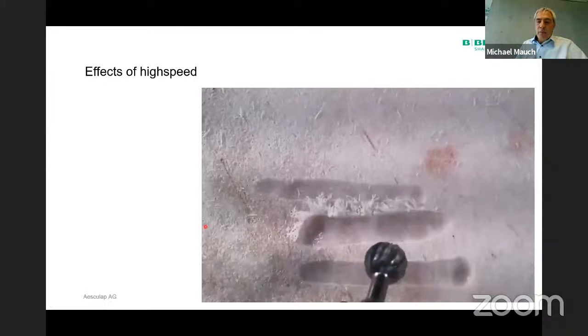But how much chattering and jumping is created by drilling against the burr rotation also depends on the burr size and the design of the individual burr. Consequently, the burr behavior will not always be the same, especially if you use different burr diameters or if you compare systems or burrs from different manufacturers. It also depends on how much bone you try to resect with each movement. If you resect smaller amounts, then the chattering will be less of an issue. If you push the burr with more force into the bone, then the chattering will be stronger. This is why we recommend to get familiar with your drill and first to do some practice, maybe on some specimen, animal bone, or even a piece of wood. Find out which working way is the best and the safest for you in the different working situations.